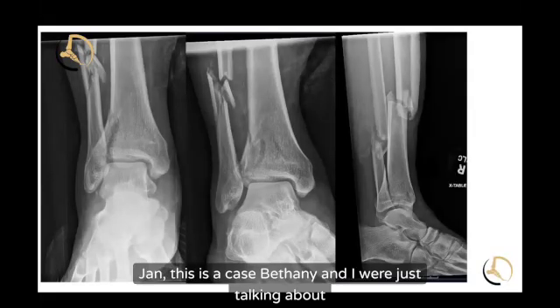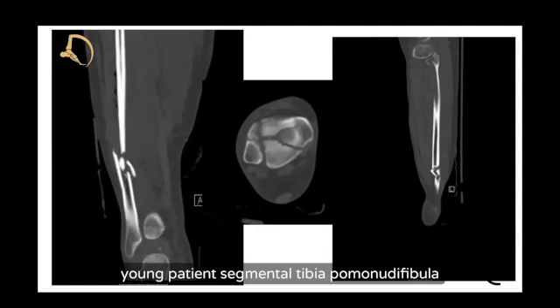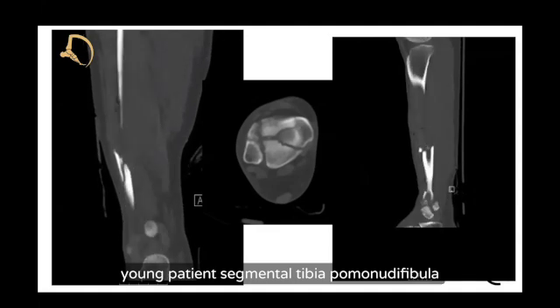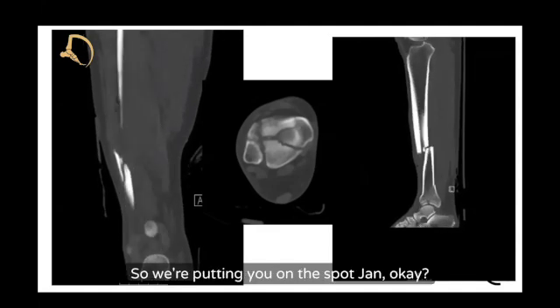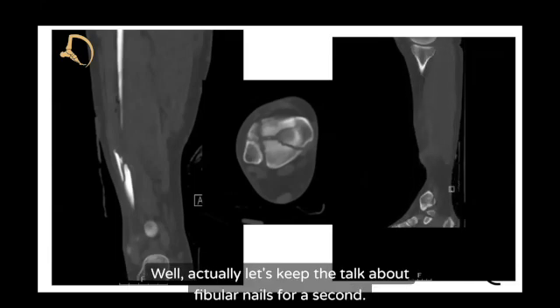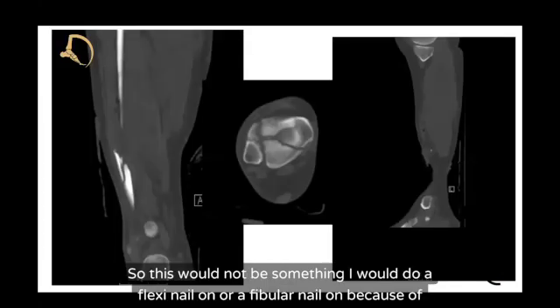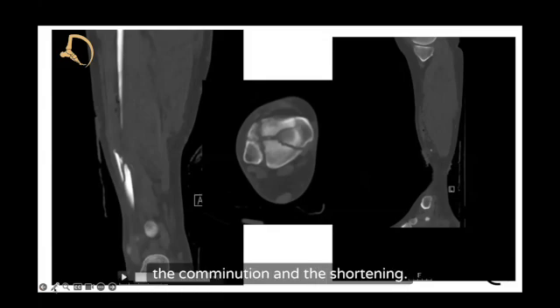This is a case involving a young patient with a segmental tibia and comminuted fibula. Keeping the talk about fibular nails and pilons — this would not be something I would do a flexi nail or fibular nail on because of the comminution and the shortening.